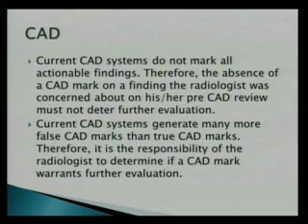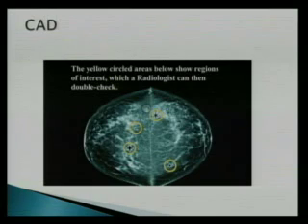It's not going to mark everything. It misses cancers. It's a computer system, so just because it's not there doesn't mean you're not going to call something back ever. That's not going to change your opinion that way. And it's all your determination. You're the radiologist, so you have to decide, do I want to call something back based on that CAD? But with our system, you push a button, the CAD markings will come on, and it'll kind of circle a lot of things. And really it overcalls, so things that are not useful.